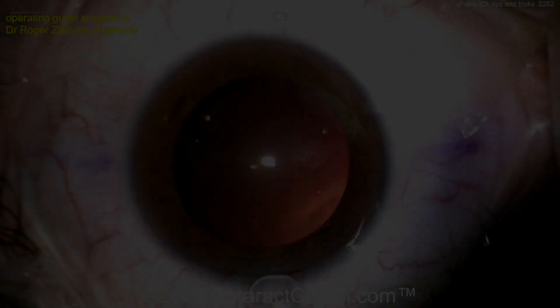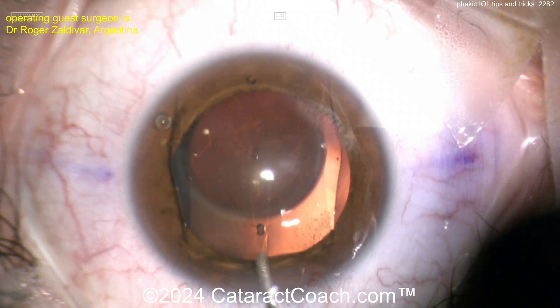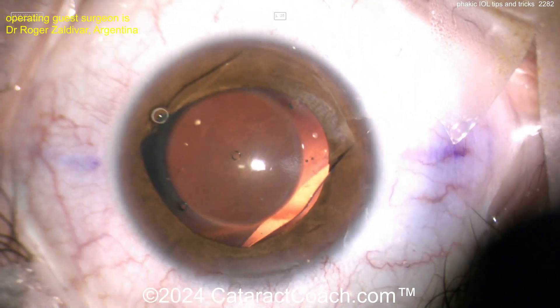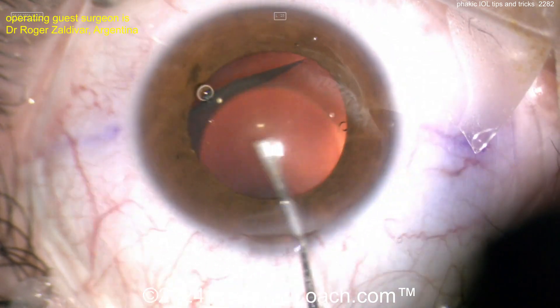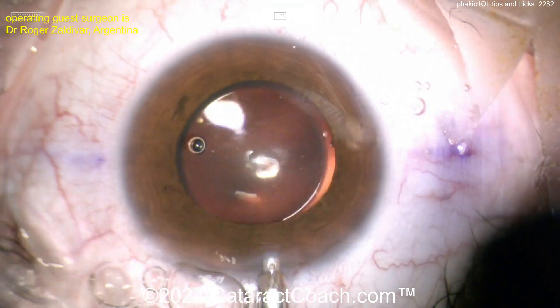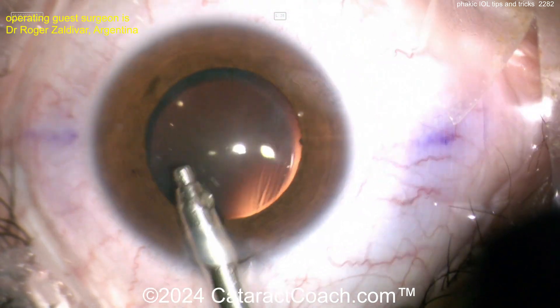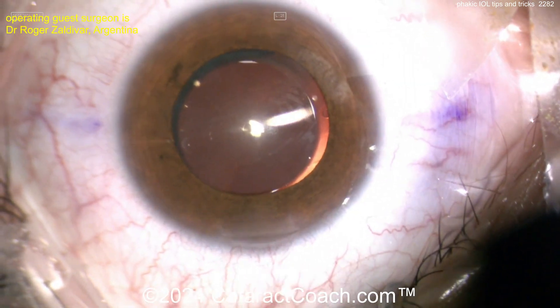But we're going to show you some interesting ones too. How about when the pupil is small? Here's one with a smaller pupil — again, the ICL going inside the eye. Here it is on top of the iris in the anterior chamber, and now a little bit of HPMC, hydroxypropyl methylcellulose. Get that lens now tucked in. Here's using this instrument to go get all four corners tucked — here's one, two, and look at that rotation as it's being tucked. Three. The viscoelastic is helping to protect the anterior lens capsule. You don't want to damage or touch the anterior lens capsule for fear that you may cause a cataract. Here's removal of the viscoelastic — that comes out pretty easy. If you don't get all the HPMC out, that's okay also — it can wash out by itself pretty easily. Maybe just give the patient some acetazolamide orally in the post-op period. Now it looks great, and at the end, just seal up the incisions.